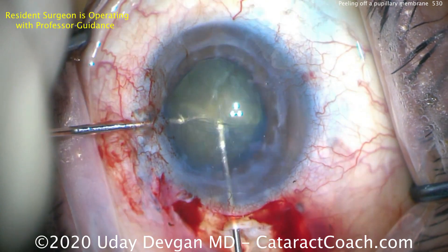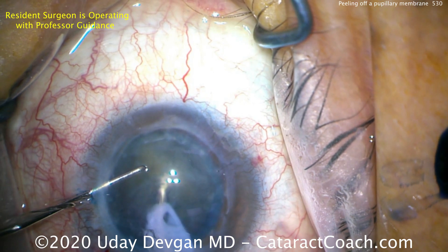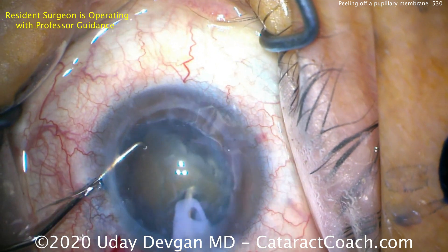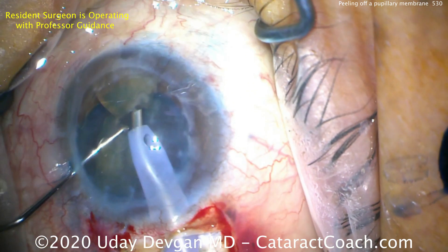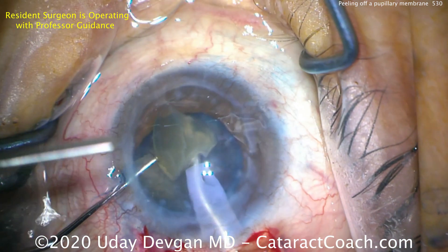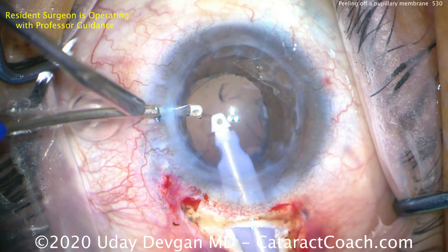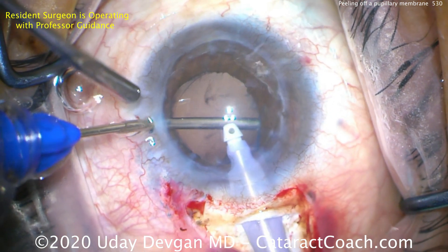We've split the nucleus — there are two halves now. We can let the resident take over to emulsify each half, bringing them towards the iris plane. The chopper goes around and we chop and remove the nucleus, staying away from the corneal endothelium of course, as this is a transplanted eye with a low endothelial cell count. Then manual cortex removal with the I/A system to clean everything up nicely.